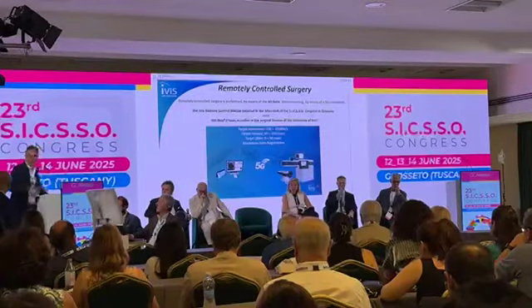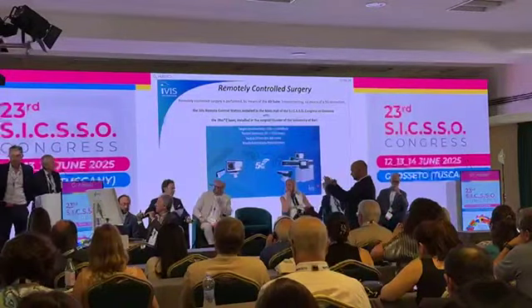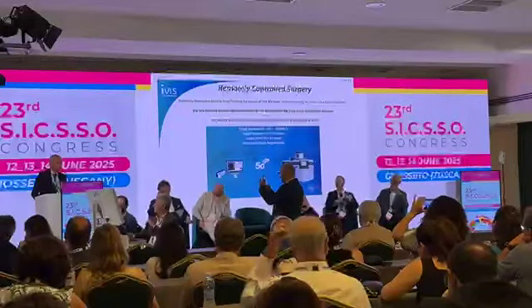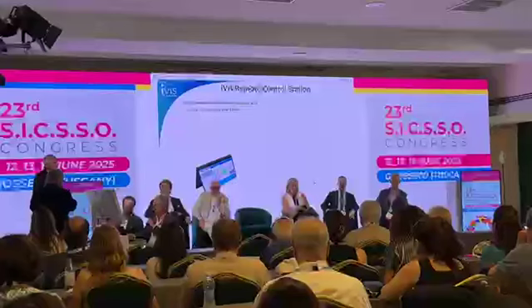Okay, next step, technical details from Giuseppe D'Ippolito. Okay, I start. Thank you. Just a couple of pieces of information about what you will see. Professor Alessio here, with this remote control, will control the laser in body. What is very important is to control by 5G the latency, because we need a very short latency. On top of that, the surgeon has a 3D laptop, where he can control the laser, a 3D monitor to visualize, and a joystick to stop the surgery, which will start right now.